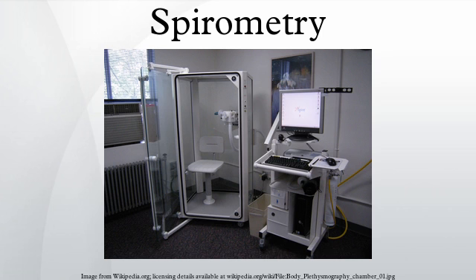disease. More rarely, forced expiratory flow may be given at intervals defined by how much remains of total lung capacity. In such cases, it is usually designated as for example FEF 70% TLC, FEF 60% TLC and FEF 50% TLC.